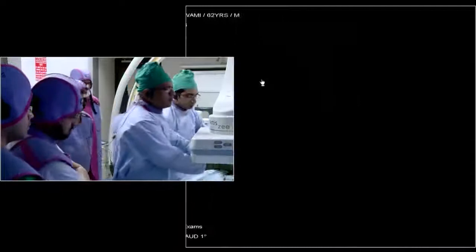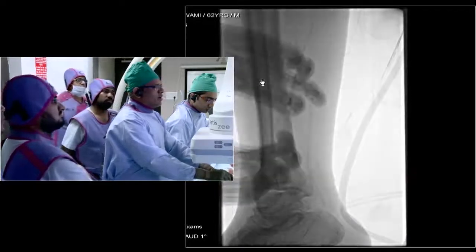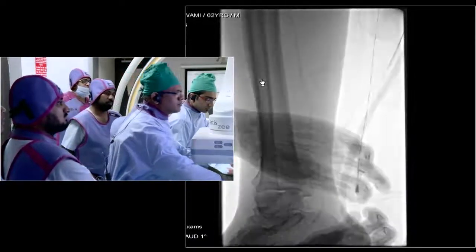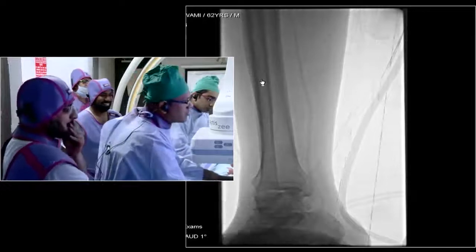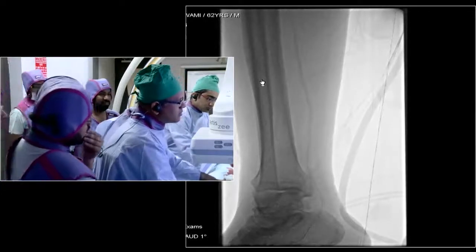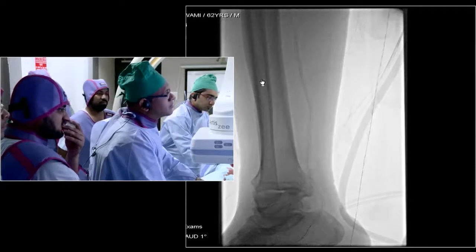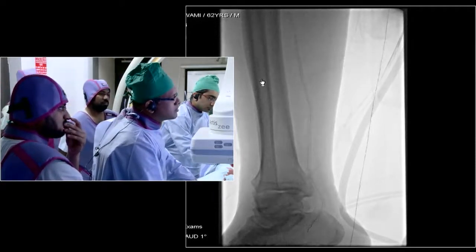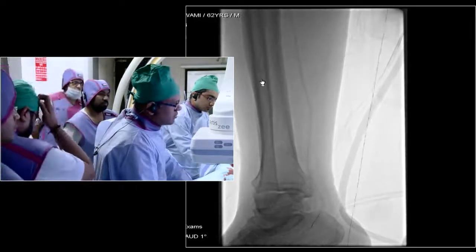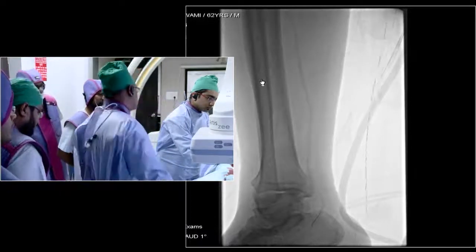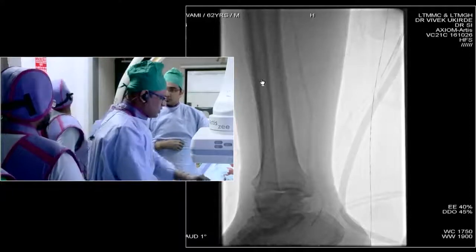Which wire have you used — a filter or Command wire? This is a 0.014 Command wire. I use either the Command or Nitrex below the knee. It is very important — I keep telling my colleagues — that your number of wires and catheters should be limited. There are so many things available in the market; get used to one or two of them and just use them consistently, and that will help you in the long run.